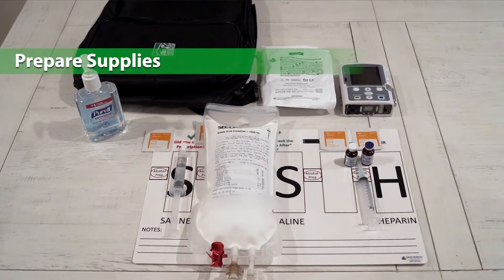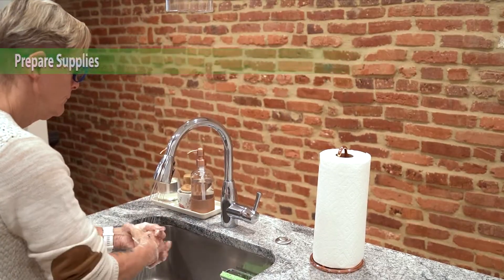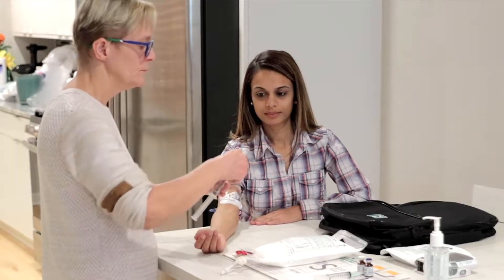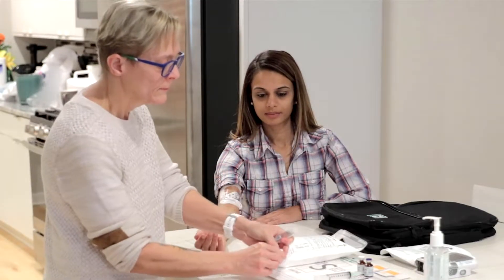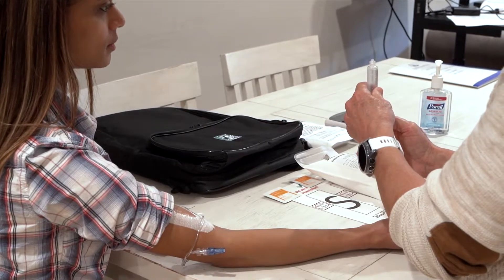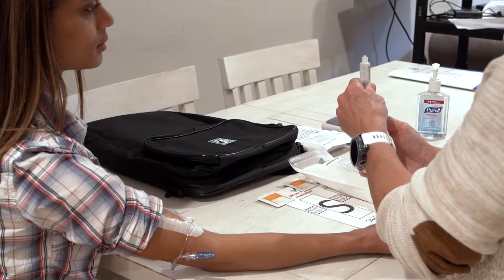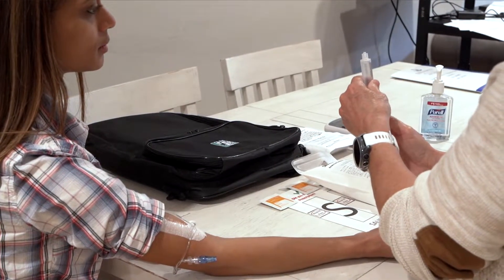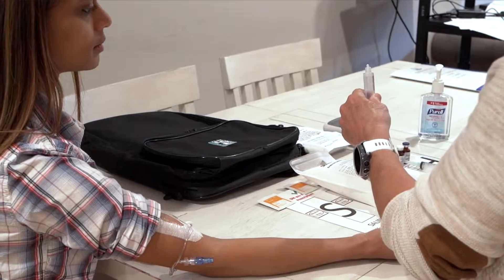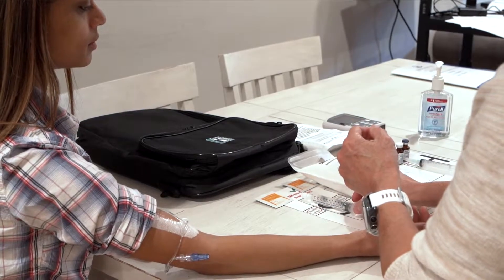Now let's prepare your supplies. Wash your hands. Place an alcohol pad and one saline syringe on the sash placemat. Pick up your syringe. Remove the protective cap from the syringe and place the cap flat side down on your sash mat. Hold the syringe with the end up and the plunger at the bottom. Pull back on the plunger slightly to break the seal. You will be able to see the air bubble in the syringe. Slowly push the plunger up to let the air bubble out. Once the air is removed, pick up the cap from the table and put the cap back on the end of the syringe. Do not touch the inside of the cap. Place the syringe back on the sash mat.